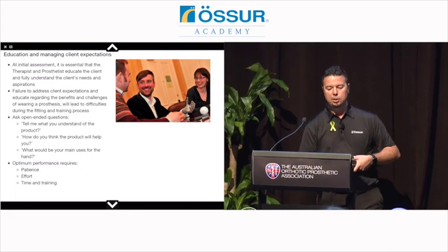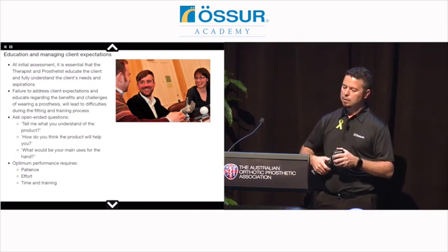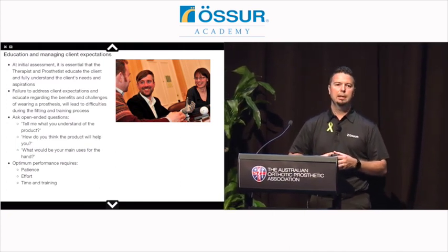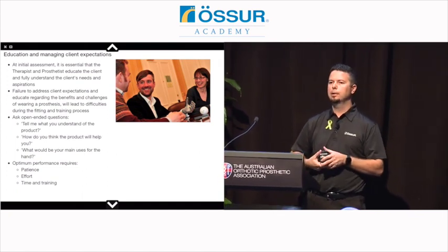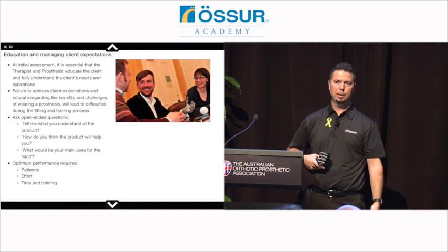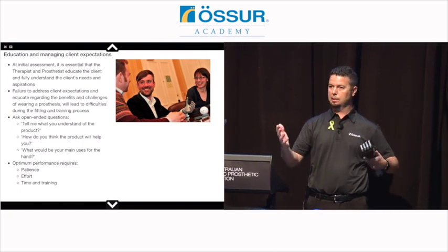Back to education and managing client expectations. If you have somebody that you're not sure if they understand the capabilities of the hand, you want to ask them open-ended questions. What do you understand about the product? What would be your main uses for the hand? Typically when you ask them something like that, it's, well, I want to get my hand back, or go back to doing what I did before. Well, those are great, but then you need to dial in a little bit more. What things are you having trouble doing now? And if it's been a long time since their accident, or maybe it's a congenital anomaly, they've never experienced two-handedness.